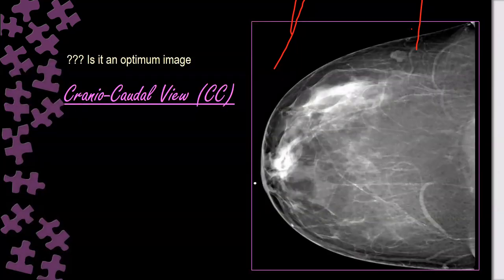What about this? This is my patient. Also, it's not optimal: the inferior part and medial part. Who said adequate? Inadequate, like the nipple not in profile. But it is accepted. Yes, the medial portion is not apparent, not well demonstrated. But I agree with you. The pectoral is visualized and you can see a far distance between the end of the breast tissue and the chest wall.